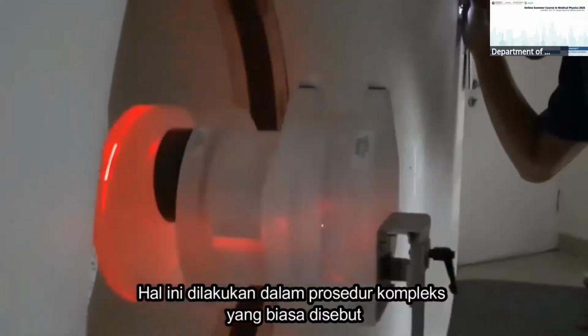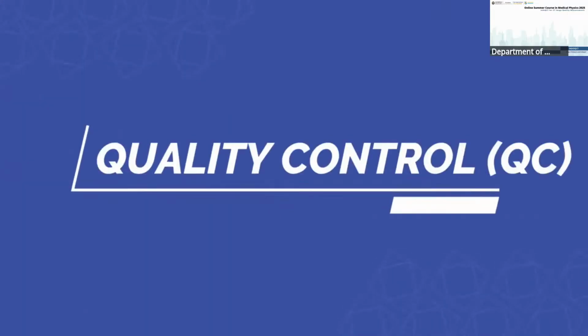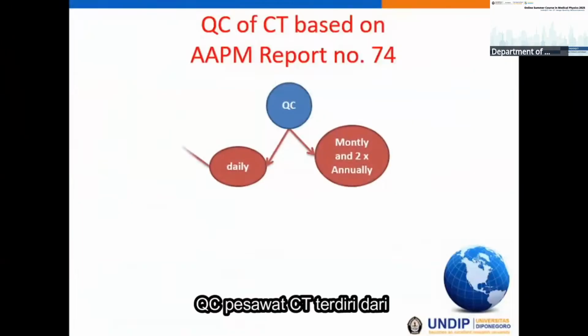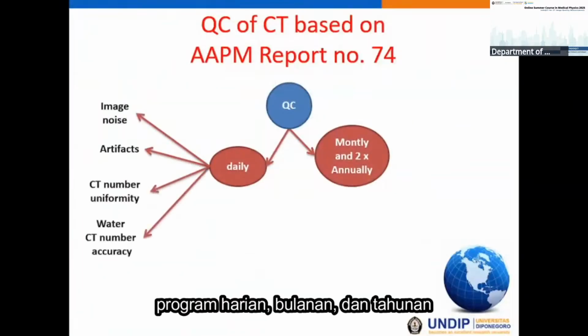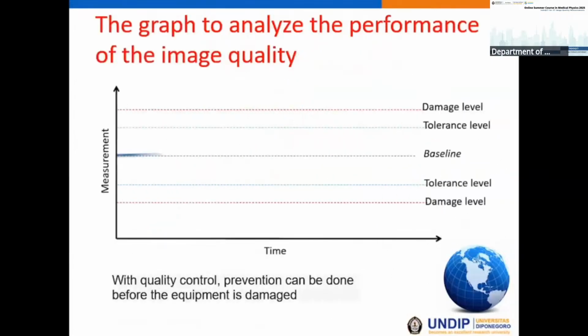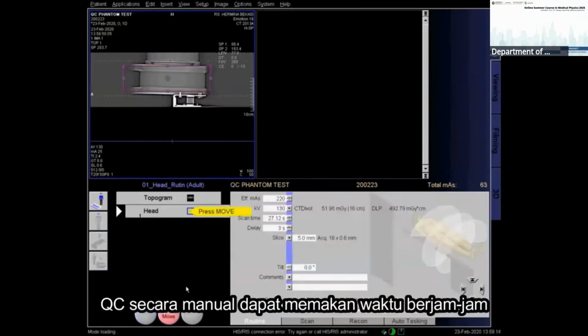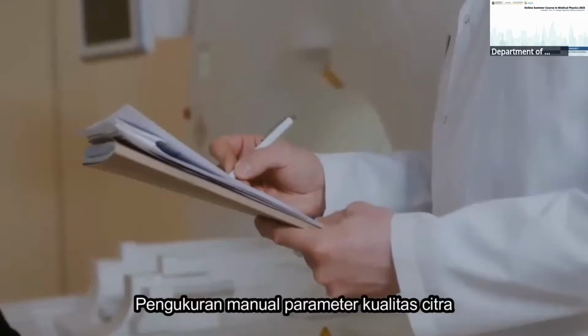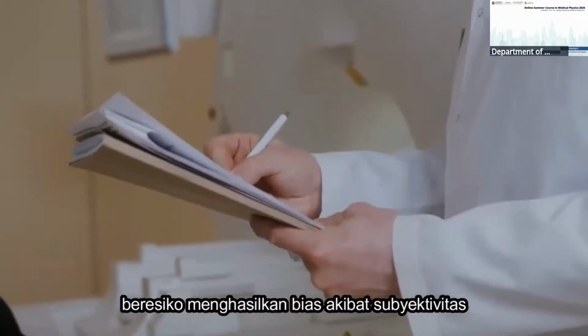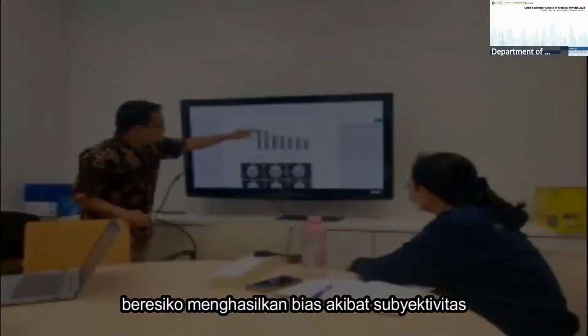This monitoring is done by a complex procedure known as quality control or QC. The QC procedure consists of daily, monthly, and annual tasks. Each procedure is time-consuming. Manual QC can take many hours. Manual measurement of image quality parameters can also lead to a bias due to the subjectivity of examiners.